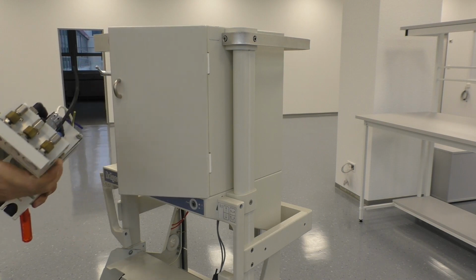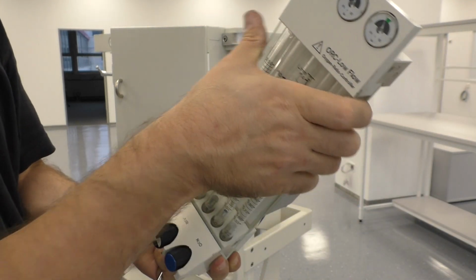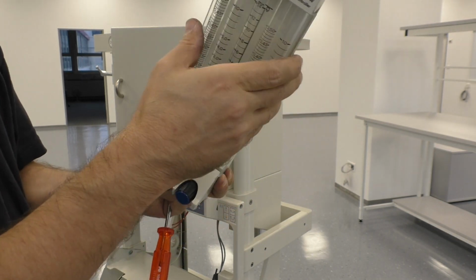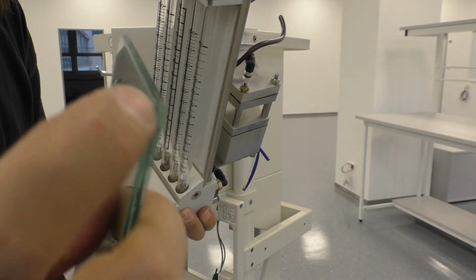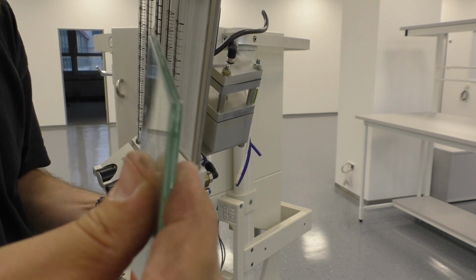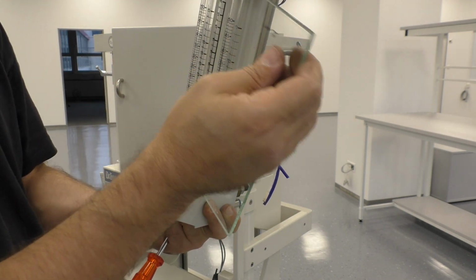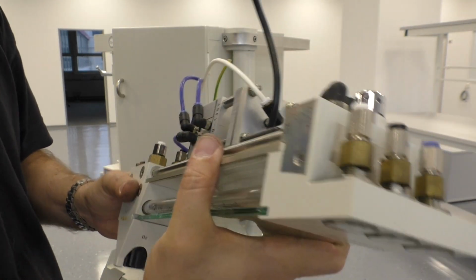Okay, all the hoses are already cut away. Oops, the glass is coming off. It's a safety glass with 2 layers and something in between, because you could probably have high pressures here, and if something bursts, it's not good if it flies in your eyes.